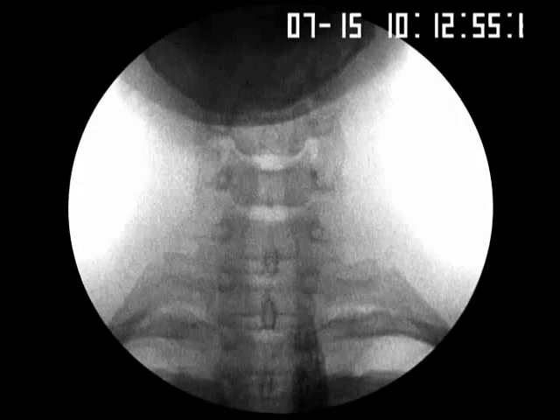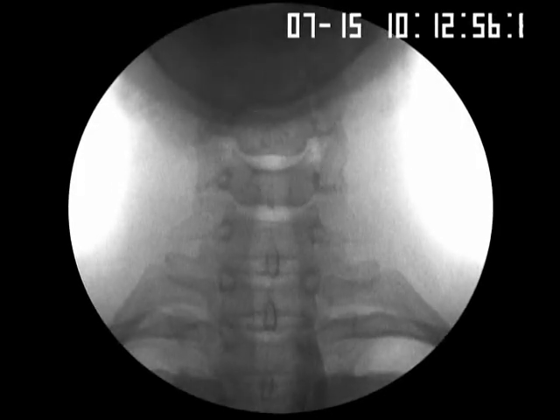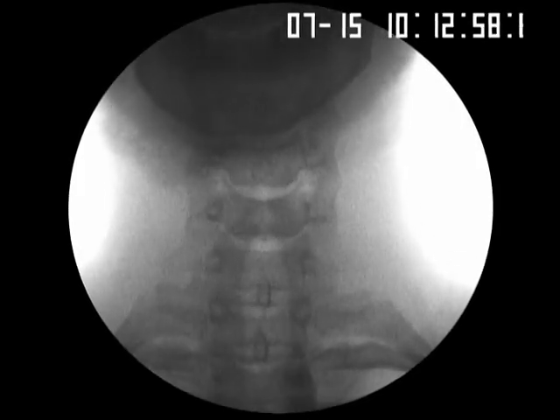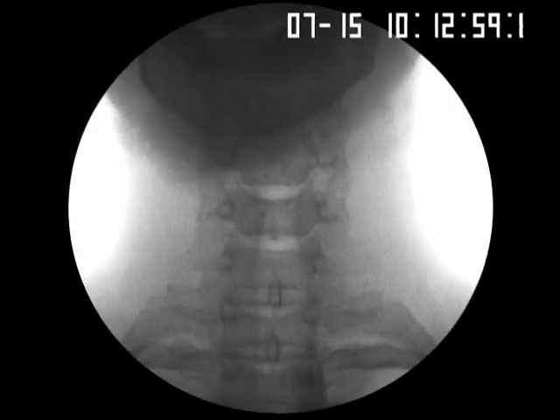Okay, I want you to just put your chin up a little bit and say E. Okay, I'm going to give you another teaspoon of that pudding. Just look straight ahead when you swallow that.